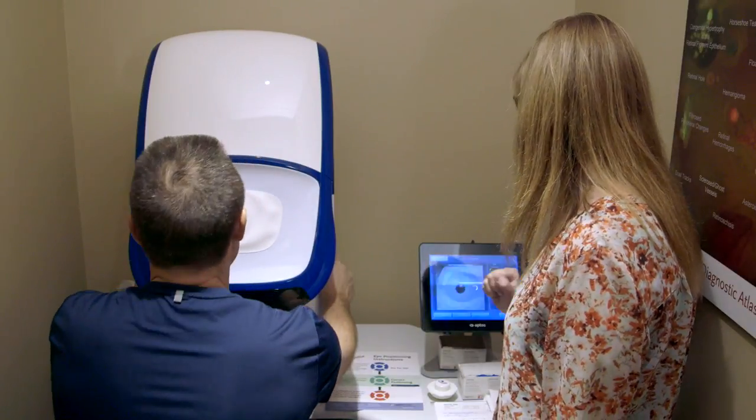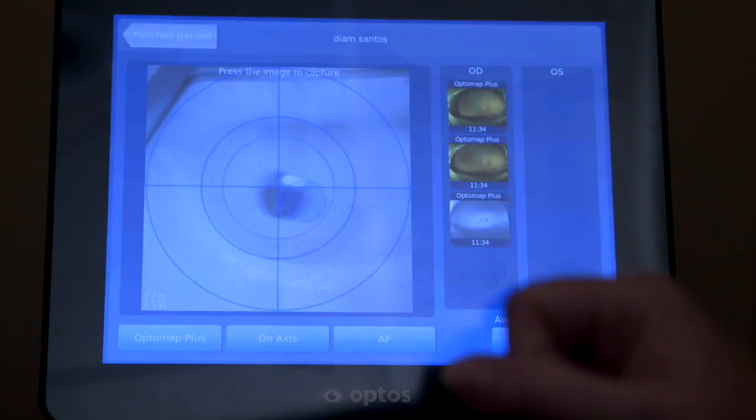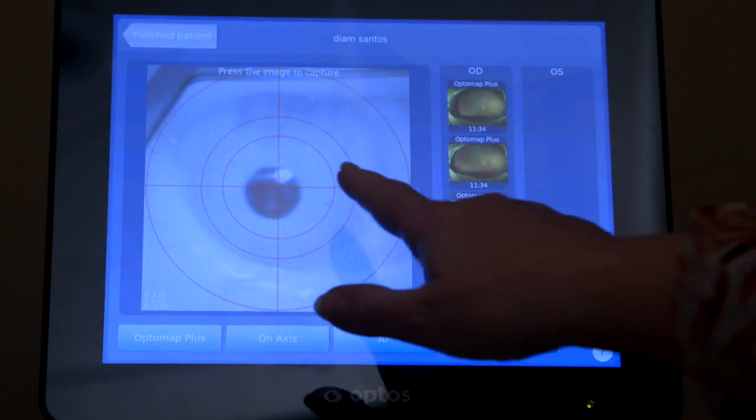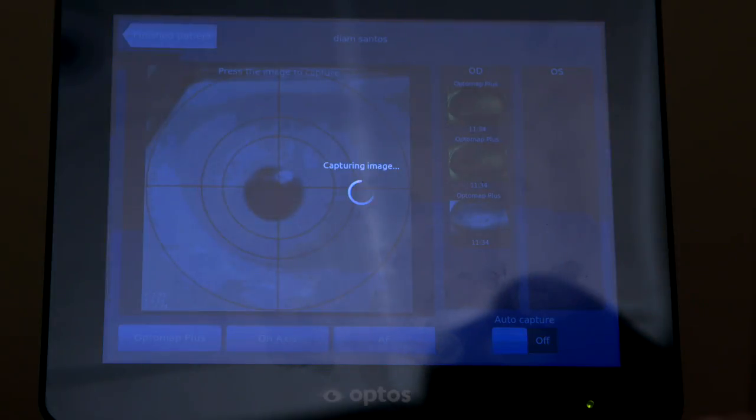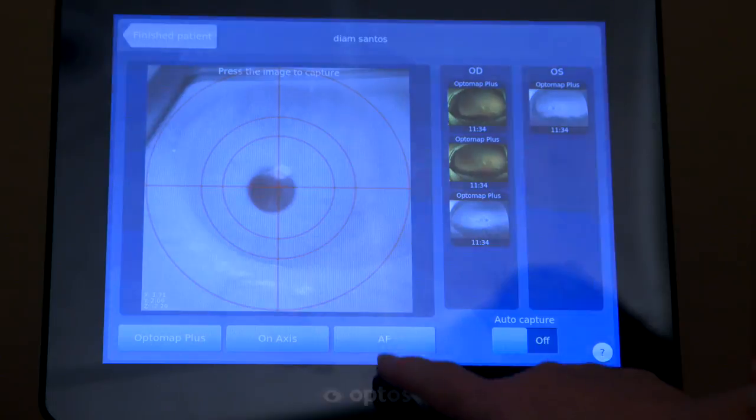The process is fairly simple. The optometric assistant will align the patient's eye into the machine. There will be a bit of a flash of light, similar to what you would get if you were taking a picture with an ordinary camera. Within seconds we take pictures of the back of the eye.